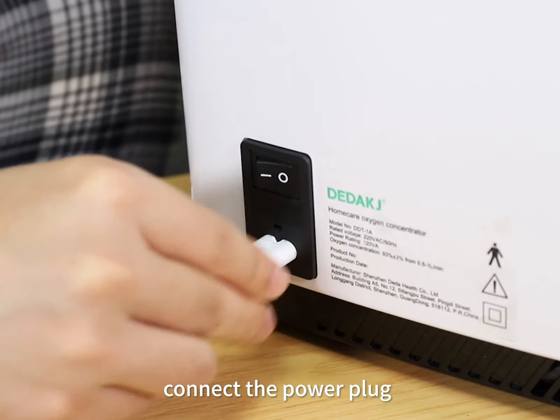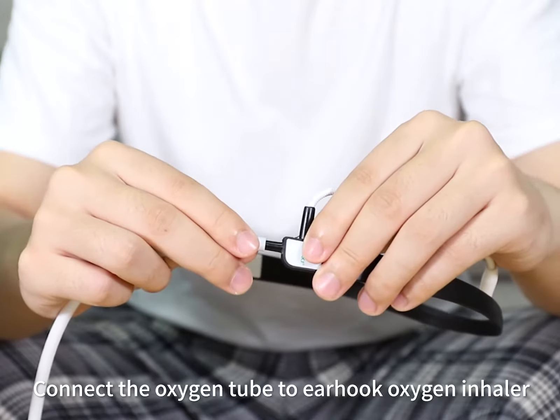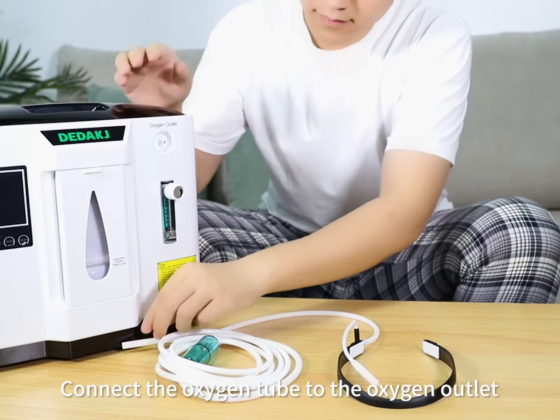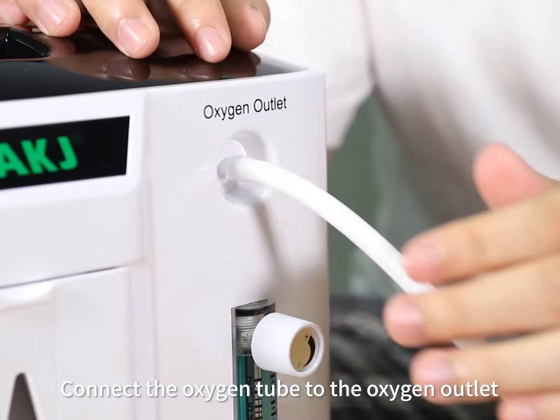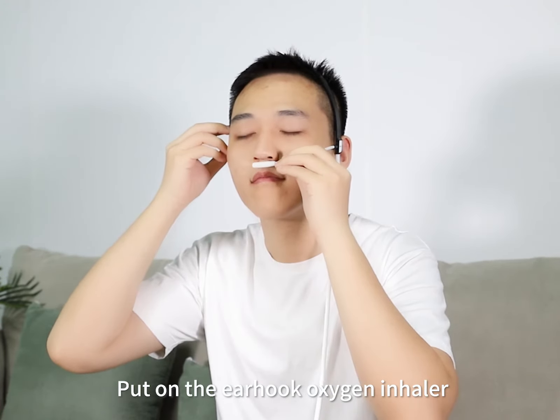Connect the power plug. Connect the oxygen tube to the ear hook oxygen inhaler. Connect the oxygen tube to the oxygen outlet. Put on the ear hook oxygen inhaler.